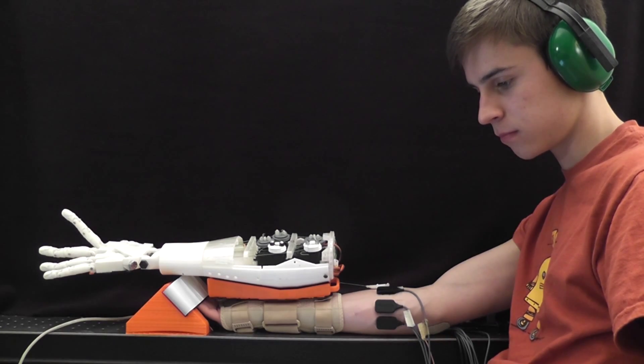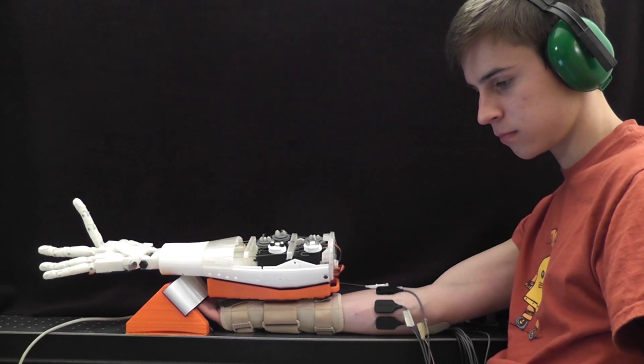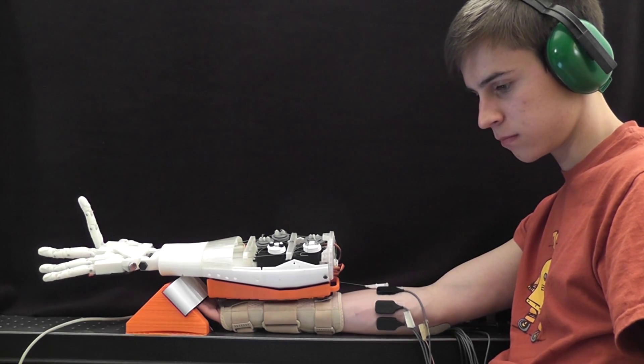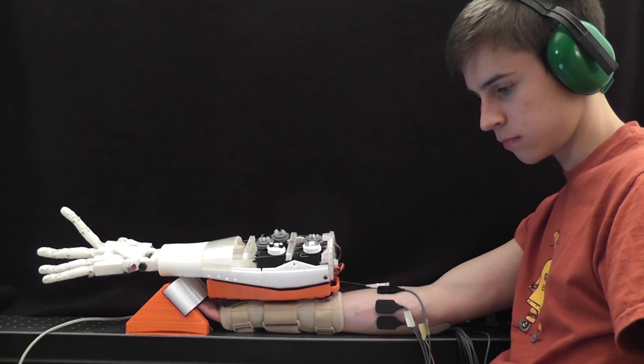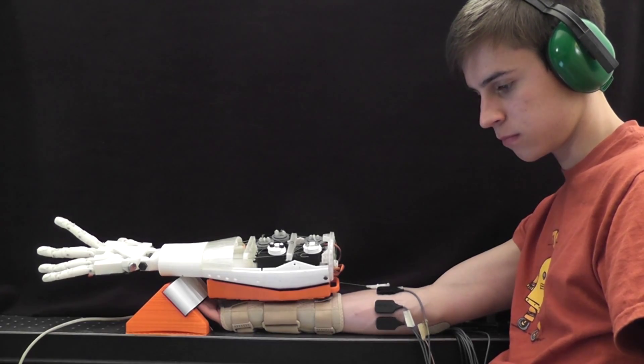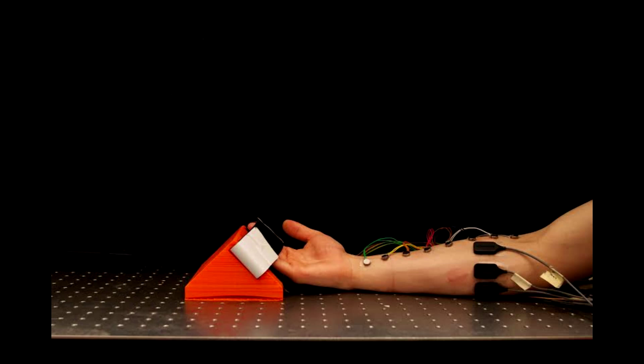Our first experiment involved controlling the angle of a virtual finger to match a target angle, while giving no positional feedback, feedback using our skin stretch device, or feedback using a vibrotactile array. For the vibrotactile array, a specific motor vibrated when the finger angle entered a particular range.